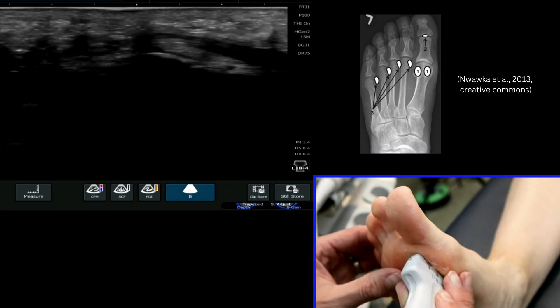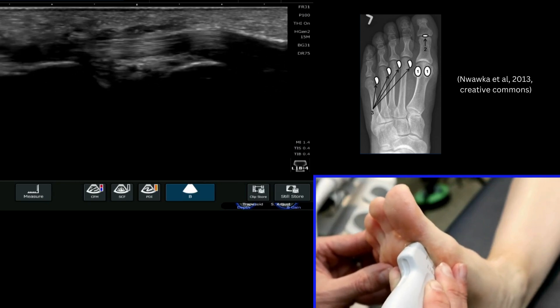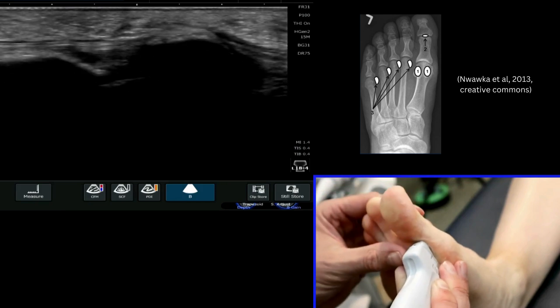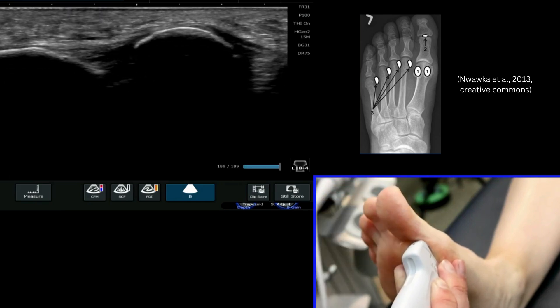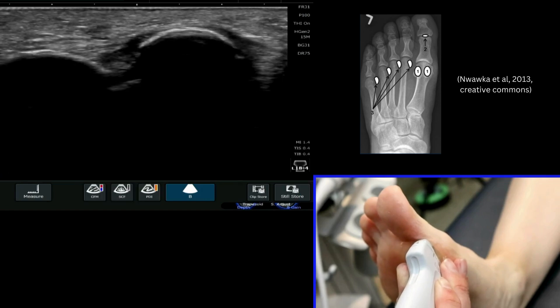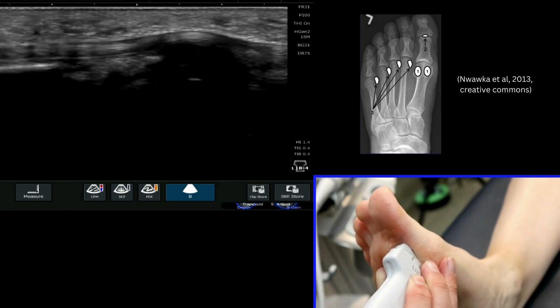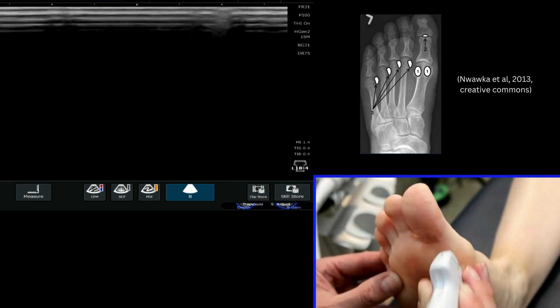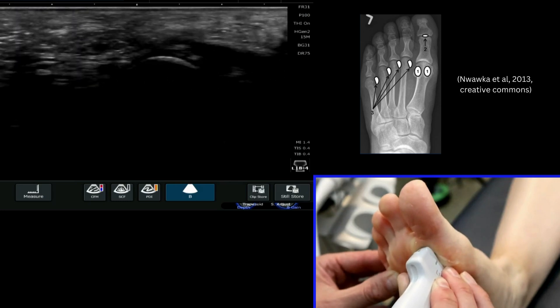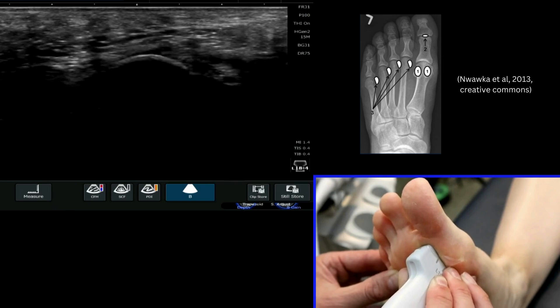If we come around in a long axis view we can see that flexor tendon really nicely now across the screen and we can move that up and down. If I travel more medially we can see that distinct outline of the medial sesamoid — it should be a smooth rounded appearance, a bit like a pebble. We can then come back across and we'll start to see the flexor tendon in between, and then the lateral sesamoid which sits a bit deeper in this instance.